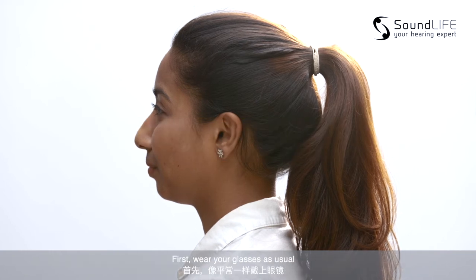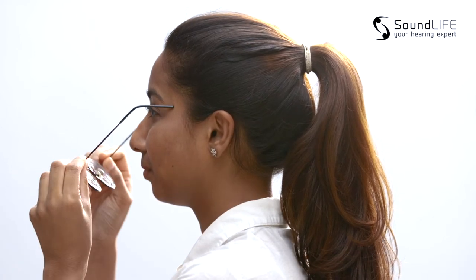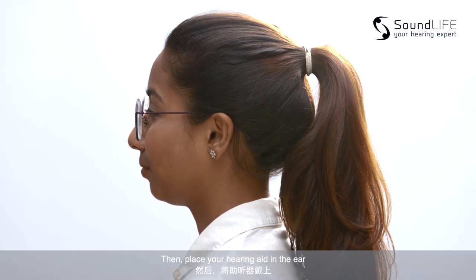First, wear your glasses as usual. Then, place your hearing aid in the ear.